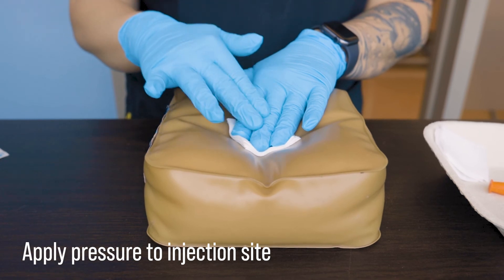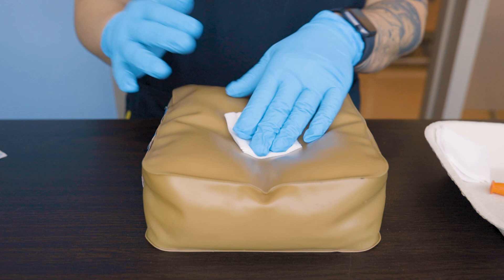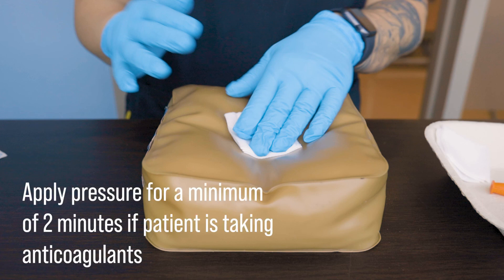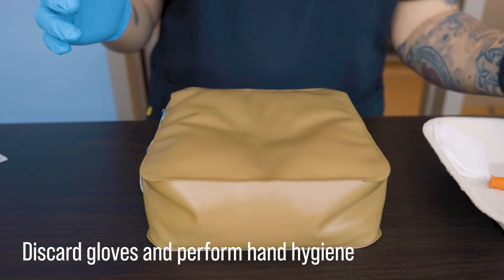Once you're more experienced, you can apply pressure while taking care of the used needle, but you have to be very careful. Remember that you may need to apply pressure to the injection site for two to five minutes if your patient is on an anticoagulant medication. And then, of course, don't forget to reassess your patient afterwards and document as required.